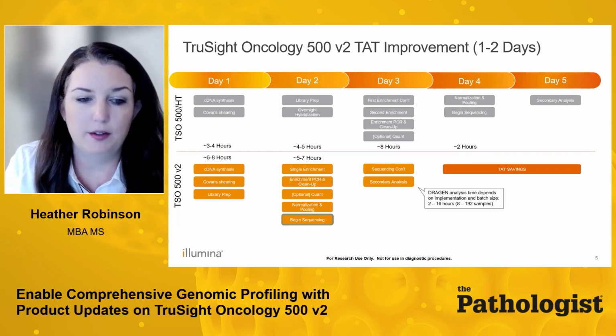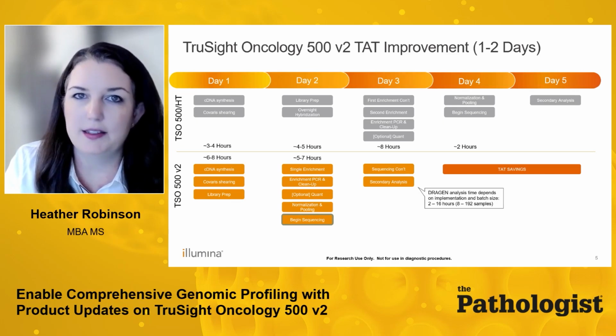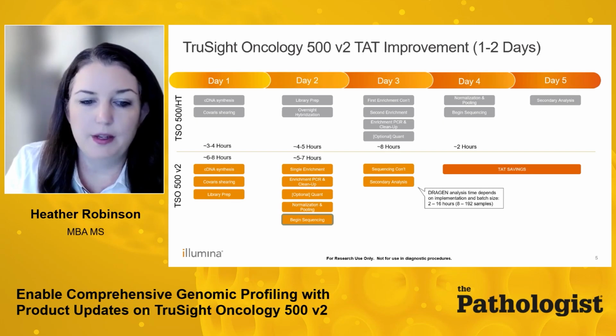With TSO 500 V2, library prep can be completed on day 1 in about 6 to 8 hours, and then enrichment, normalization, pooling, and starting the sequencing run can be completed on day 2 in about 5 to 7 hours. This time can also be further reduced by running the automation method overnight.